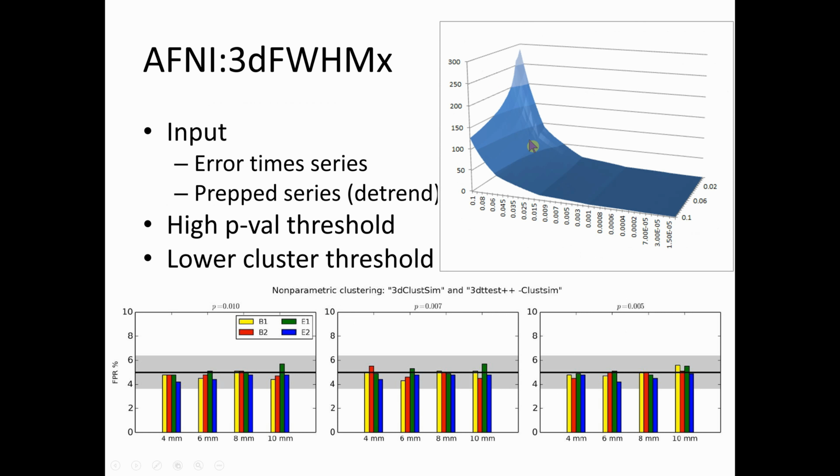And as you slip down that curve of your alpha, your voxel level and your cluster level, you're required to have smaller and smaller clusters of voxels. So this, again going back to that Wu paper, means that you have more localized signal. It's still significant, but it changes the way the brain imaging that you publish and see looks. Instead of getting these large swaths of a brain and big colors, you get little ones.